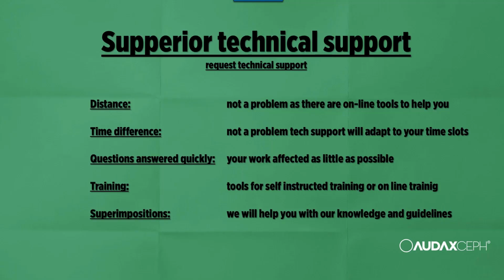We believe that technical support is the most important service to customers who start with the software, so novice users, or advanced users. We provide it through remote access, which is both productive and also social. We set up our workspace in a way that we can productively help you regardless of the distance between us and regardless of the time zone.